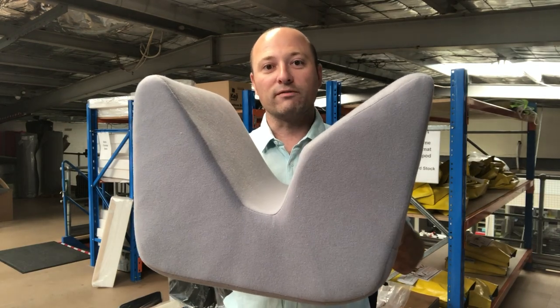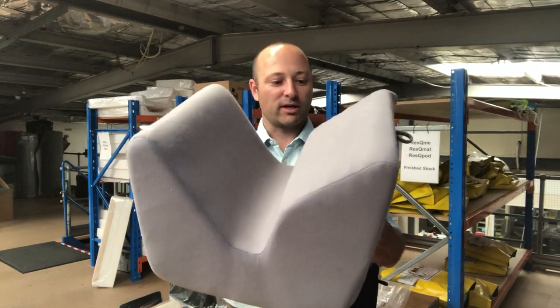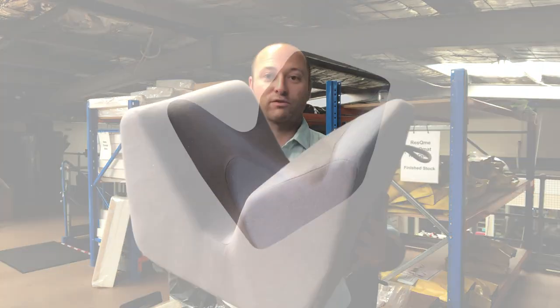This is the leg support with grey velour cover. It's a new product cover with a nice soft grey velour material.